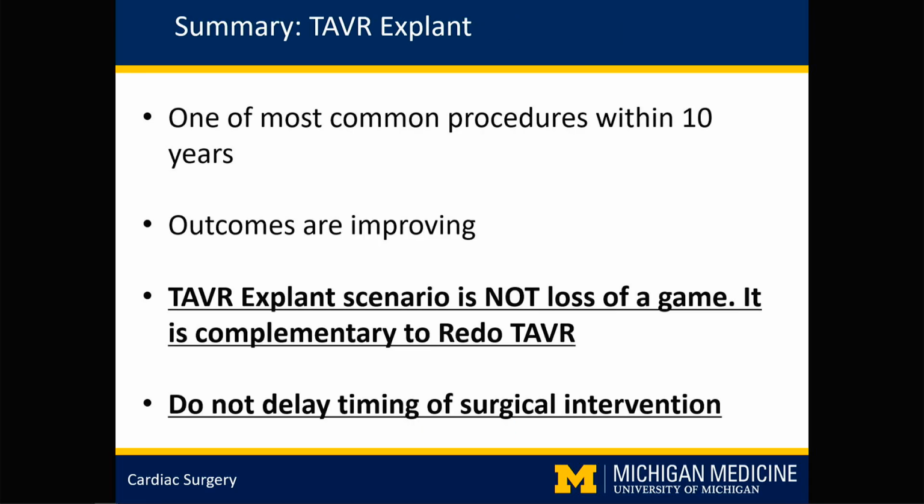So in summary, TAVR explant will be one of the most common procedures within 10 years. Outcomes are improving, fortunately. A TAVR explant scenario is not the loss of a game. It's complementary to redo TAVR. So please do not delay the timing of a surgical intervention. Thank you so much.